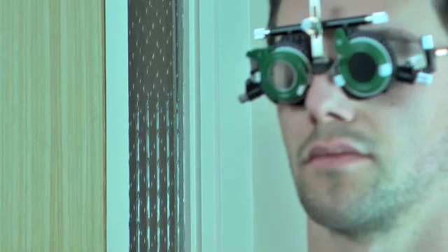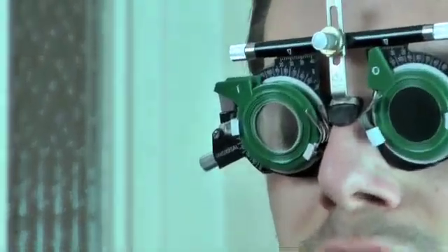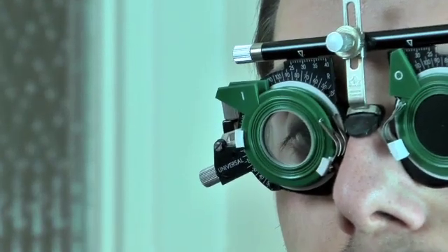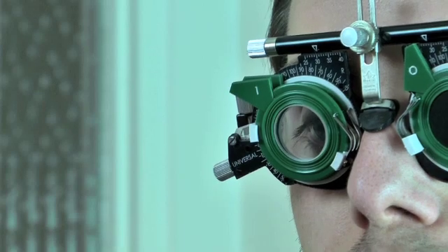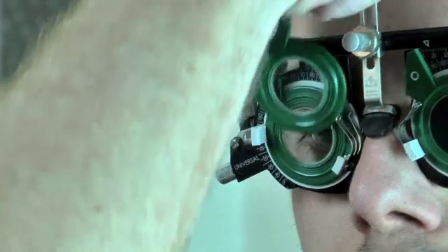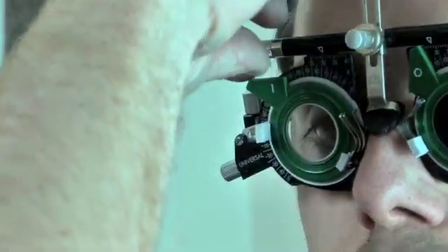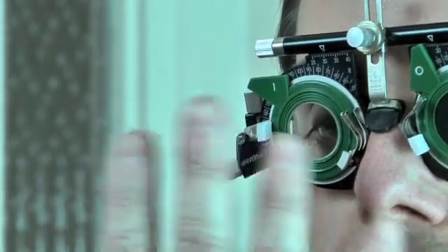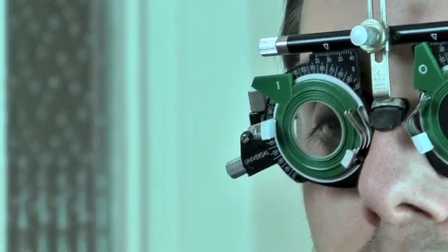Is it better? Is it worse? Or is there no difference in the vision? If he says it's better, then we need to add some more plus. So what I would do is take these two out. We'll keep that one in to keep the accommodation relaxed, so we'll just take one out and replace it with a plus two.